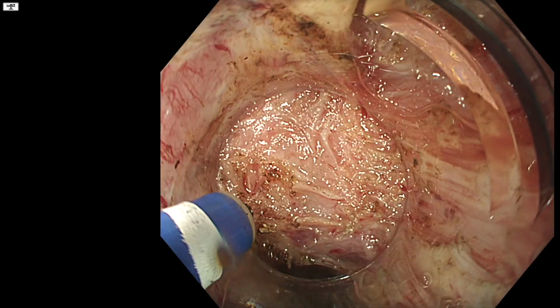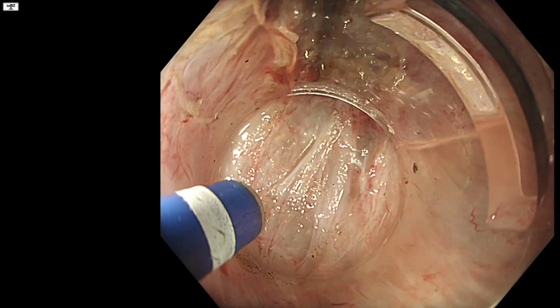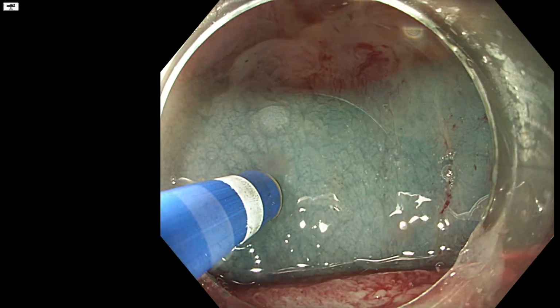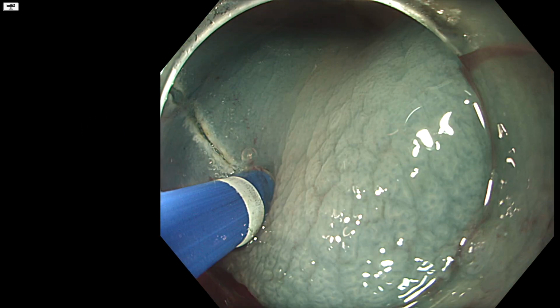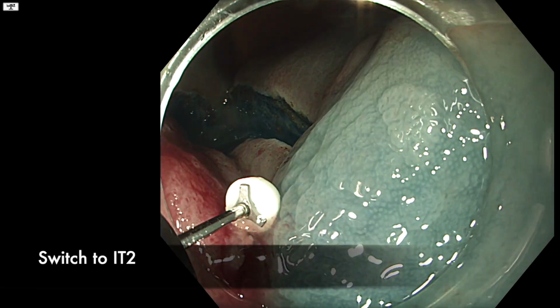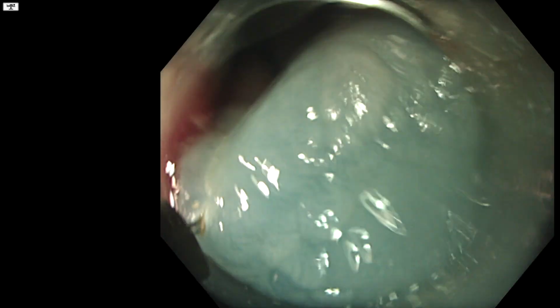Okay, so back to the procedure. As you can see, progress in the pocket is slowing. We're working in a very confined space and dissection is becoming a bit laboured. So at this point we make the decision to open up the circumferential incision and try and restore working conditions in an open field. For this we decide to switch to the IT2 knife, which as you can see is much faster during the mucosal incision.